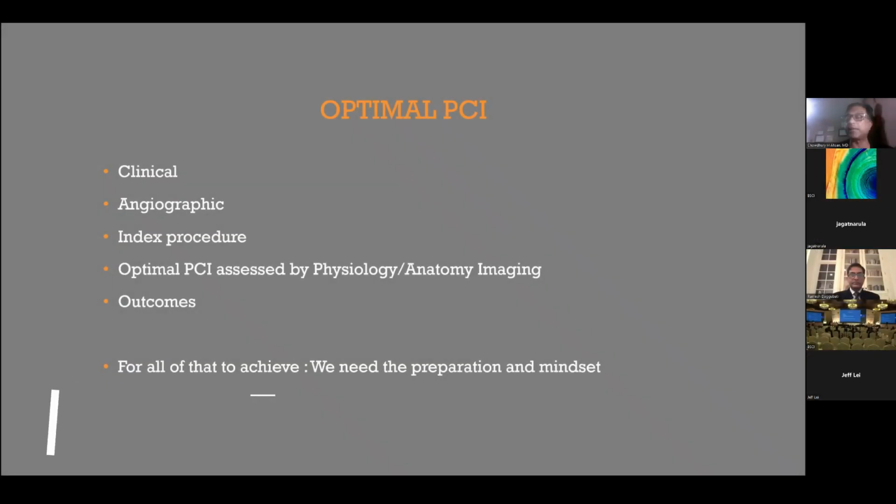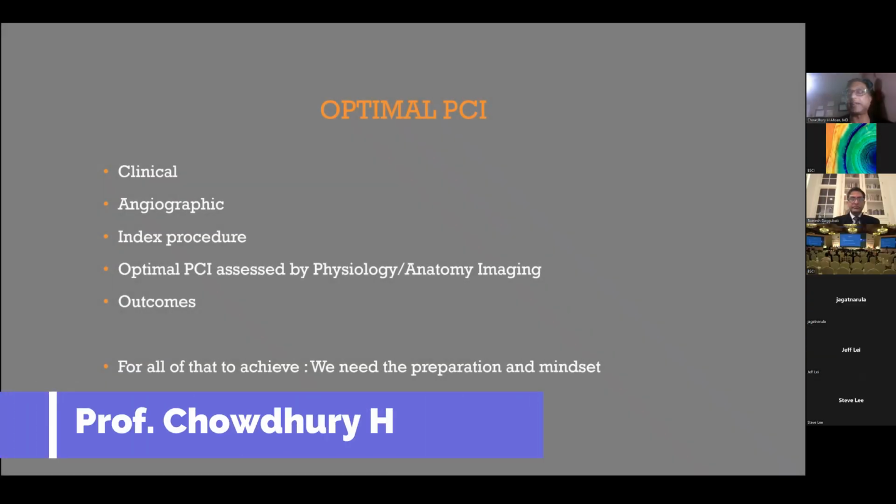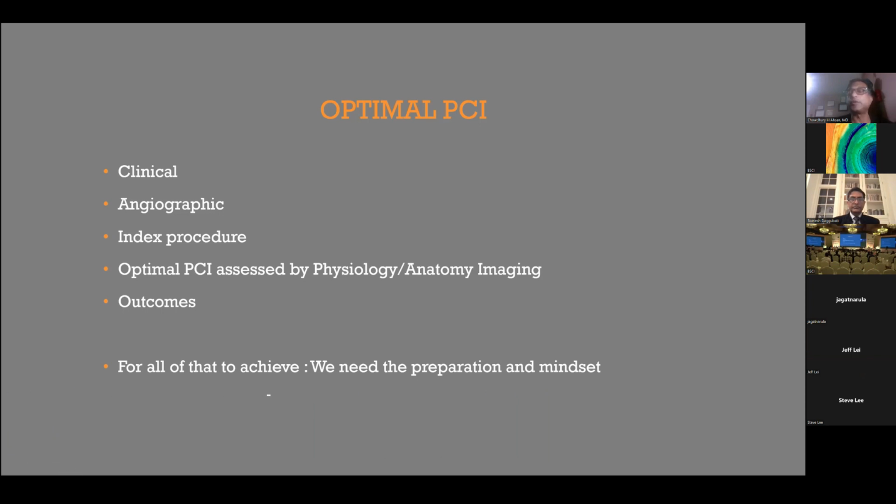which has prognostic implication, or significant anatomic proximal LAD, which has significant prognostic implications, or you are in the middle of the night doing a STEMI, or for that matter, non-STEMI, and those have significant prognostic implications. Whatever we do, we'll have to think about how we achieve the best results when we do the percutaneous coronary intervention.